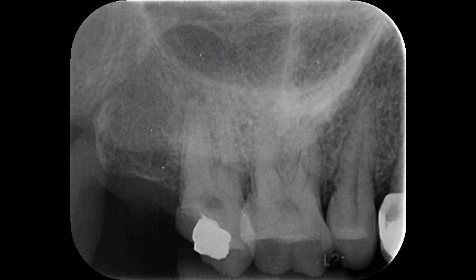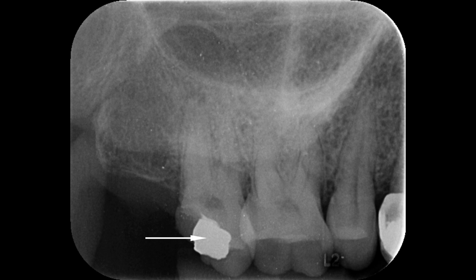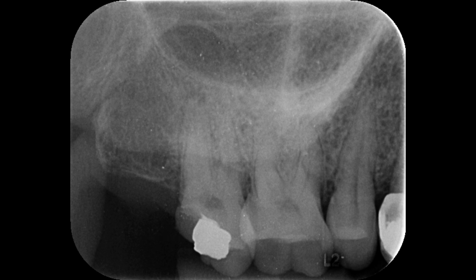This is the preoperative radiograph of the patient where you can see on the maxillary second molar tooth there is a restoration, but it is not properly placed. The distal half of the tooth is not restored properly.